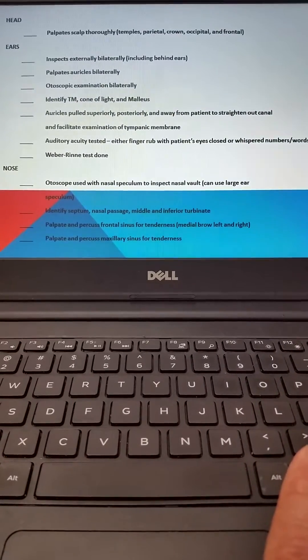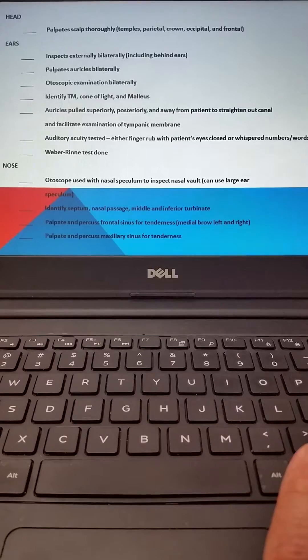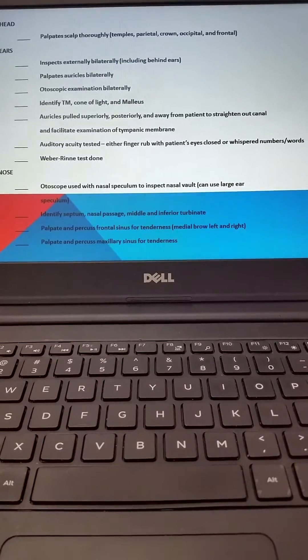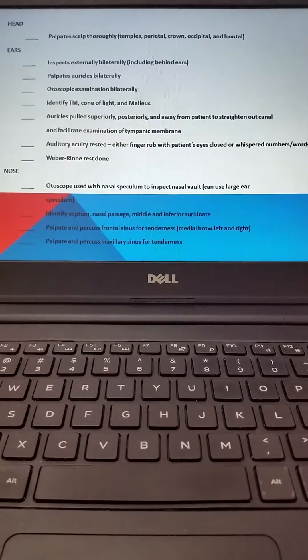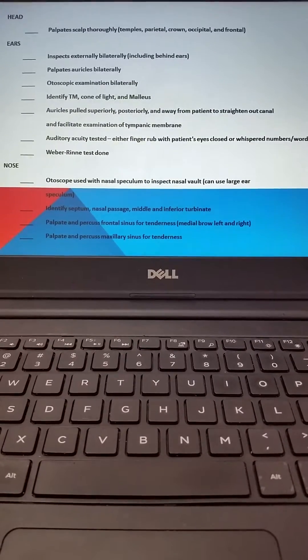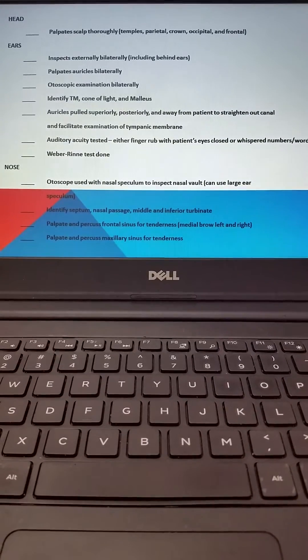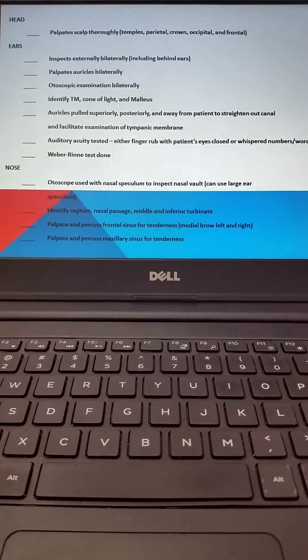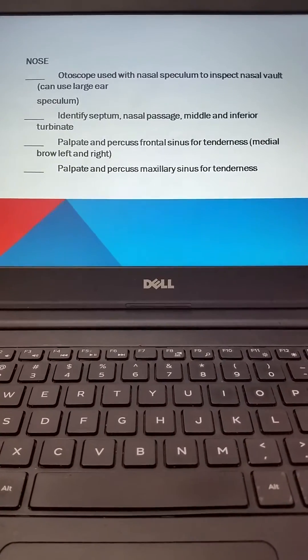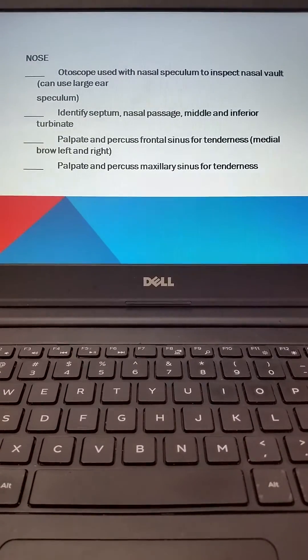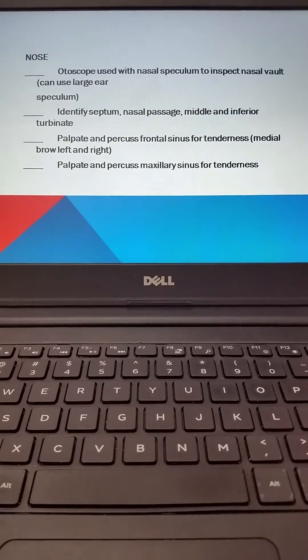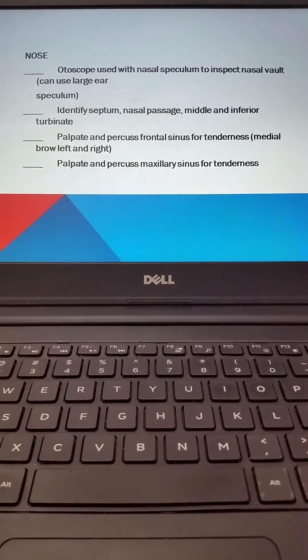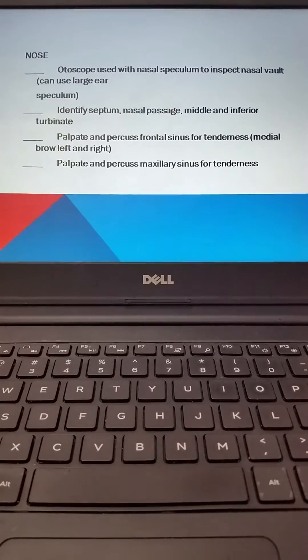The handout you'll receive during lab goes through the head exam where you palpate the scalp thoroughly, the ear exam which we've already demonstrated, and then the nose exam. In this video we're going to focus on the otoscopic exam of the nose using the nasal speculum. You can use a large ear speculum to do this exam. Identify the septum, the nasal passage, and the middle and inferior turbinates.